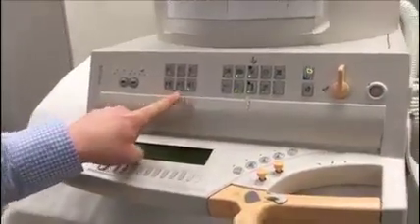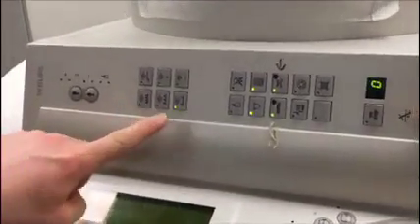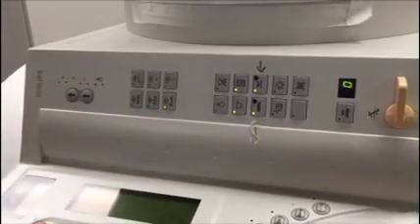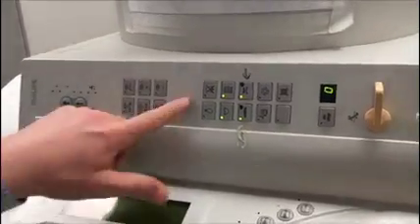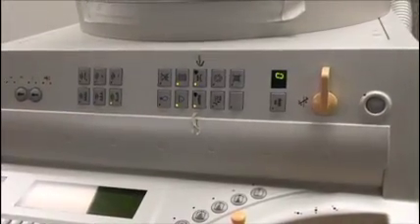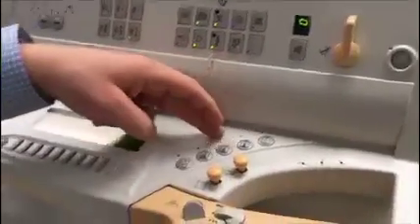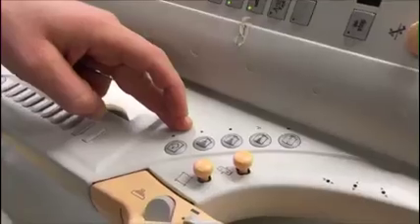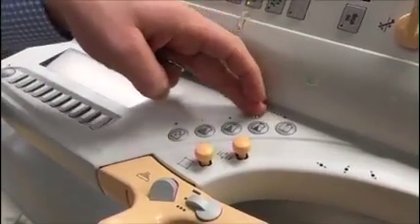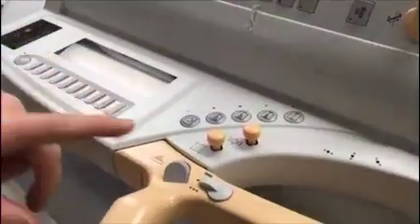For the fluoro machine itself, here are a couple of the controls that we'll go through. First is the pulse, and so you can see from right to left, this is increasing your pulse frequency. So if you were on this setting here, your pulse frequency is decreased and you're minimizing fluoro exposure. Here are the buttons for your alarm, which will go off for a certain amount of fluoro time elapsed. Here we have our series of magnification, and in descending order, this is going from less to more magnification. You obviously want this as minimal as possible.